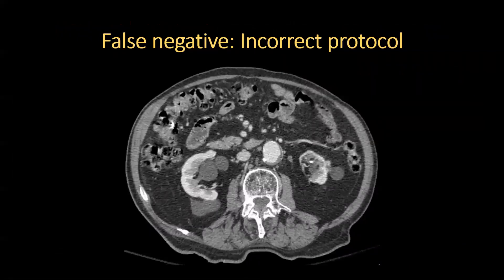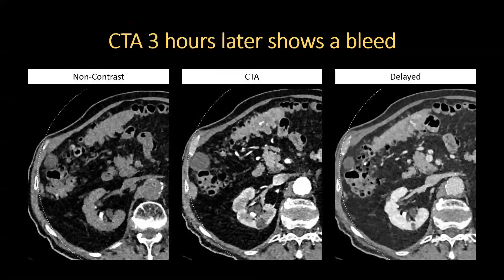A 98-year-old man presented to the emergency department with hematochezia and left lower quadrant pain. The study was protocoled as a routine CT of the abdomen and pelvis with IV contrast, and no acute abnormality was identified. Three hours later, the study was repeated as a dedicated GI bleed protocol CTA. The arterial phase shows a blush of luminal contrast material in the transverse colon that changes in size and morphology on the delayed phase, consistent with an active bleed. This highlights the importance of appropriate protocoling for diagnosis.